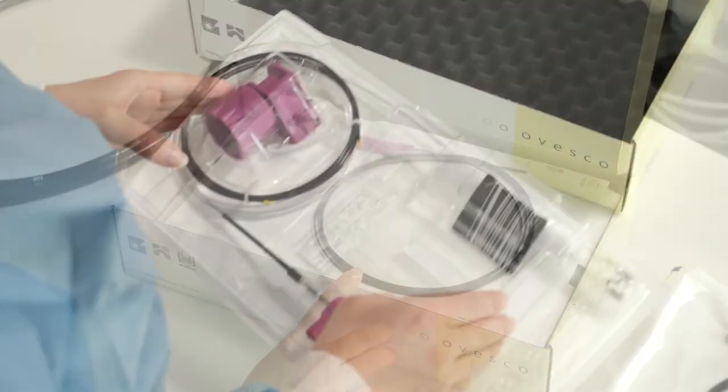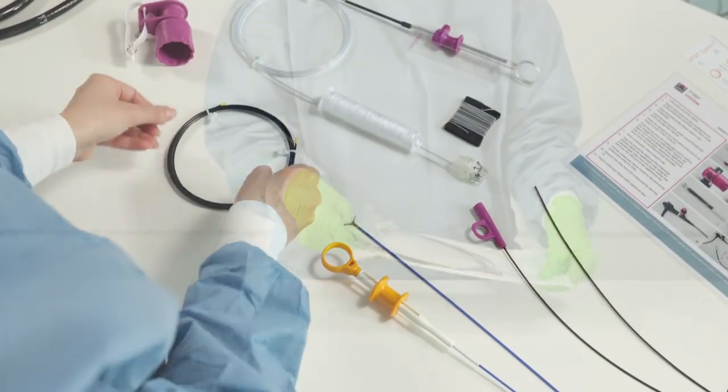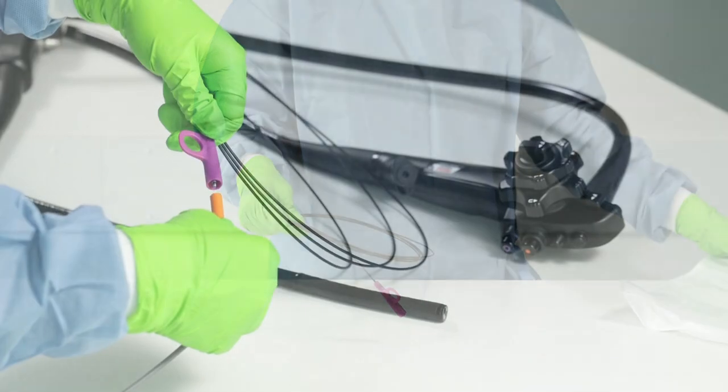Before use and setup of the FTRD, it is recommended to mark the target tissue with coagulation points, for example with the FTRD marking probe.